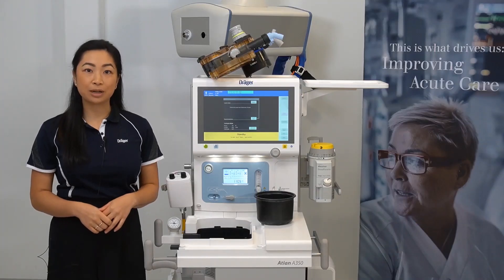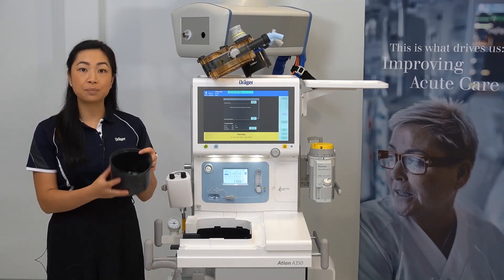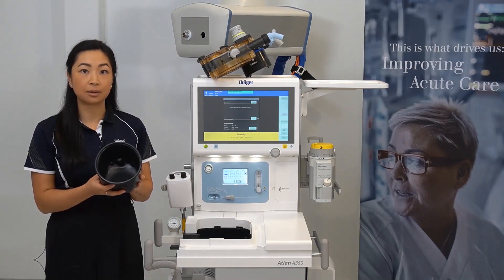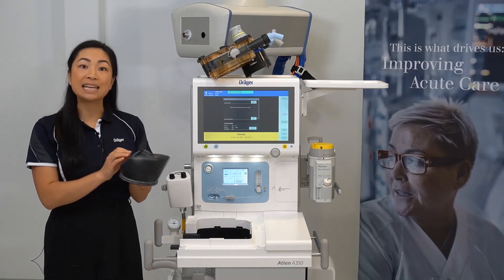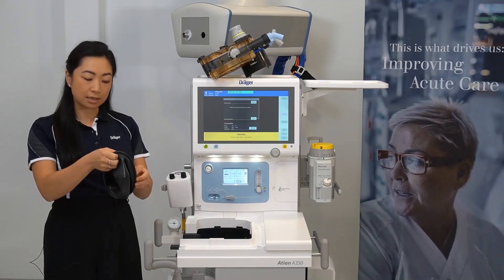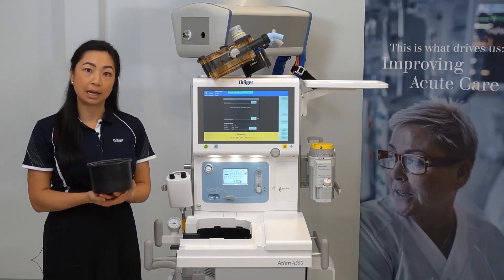To return the breathing system back to the device, start by returning the piston diaphragm to the ventilator. Just ensure that the Draeger logo seen here is on the inside of the diaphragm. This may have been turned inside out during the cleaning process.